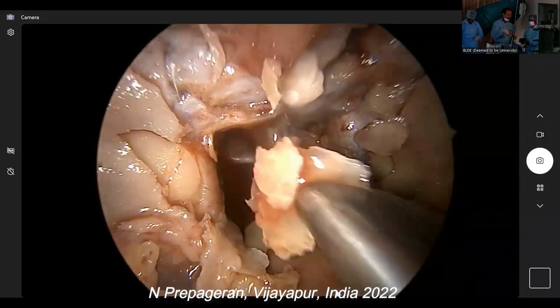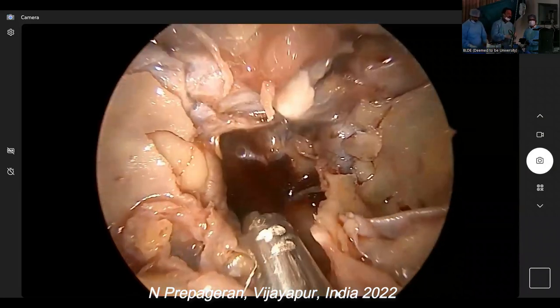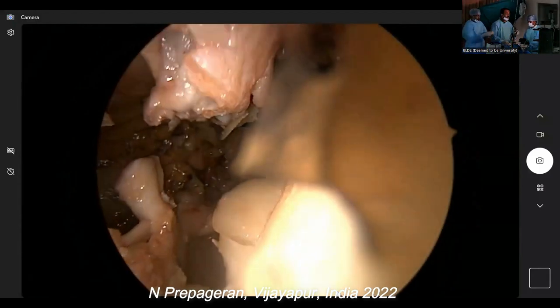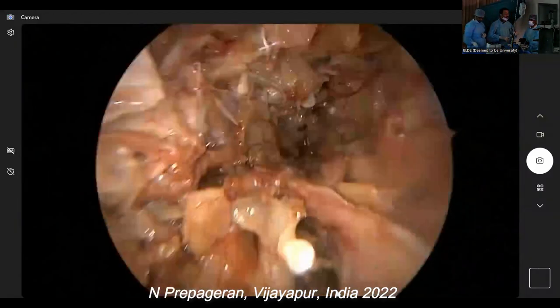Can you see, guys? Suction again? Okay, so let's see now. That's clivus. Can you see, guys? Okay. Can you punch again? This gentleman has got a lot of CSF, huh? It's like real life dissection, you know?